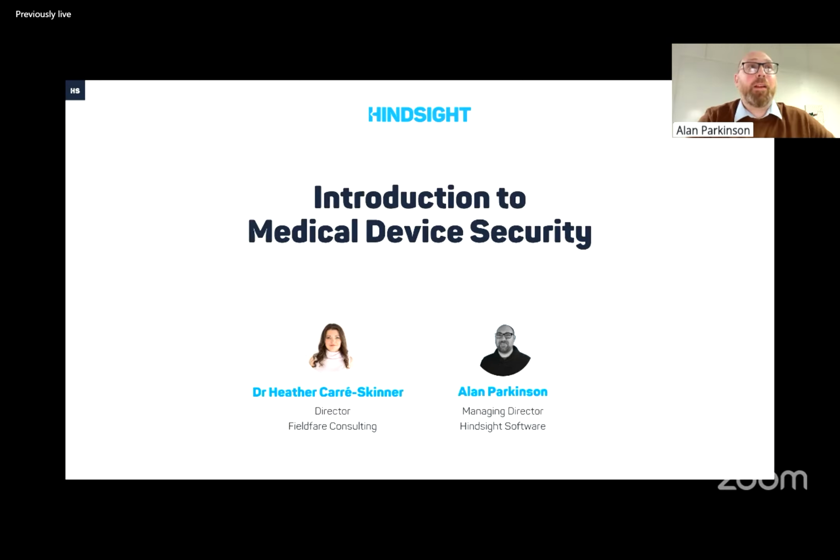You're completely right, and it does come down to usability. At the moment, there's a lot about labeling and documentation on intended use and what the environment is for a medical device, and getting a layperson to read that would be quite hard.